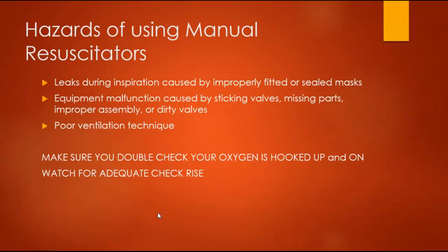I've opened up resuscitation bags before, and I usually always check them by holding my finger over the valve and squeezing the bag to make sure that I can squeeze the bag and the exhalation valve opens up. And I've done that before with a brand new bag and wasn't able to squeeze the bag, so I know something was sticking or wasn't seated properly, and I had to throw it out before I used it on the patient. Dirty valves also cause equipment malfunction.